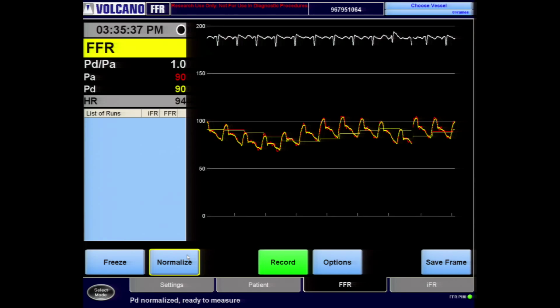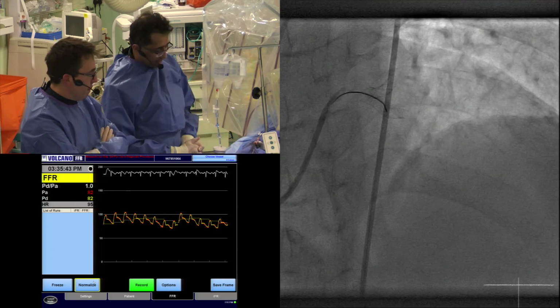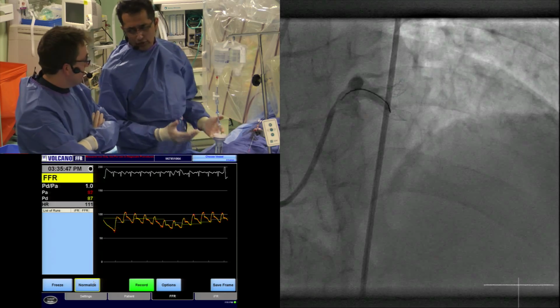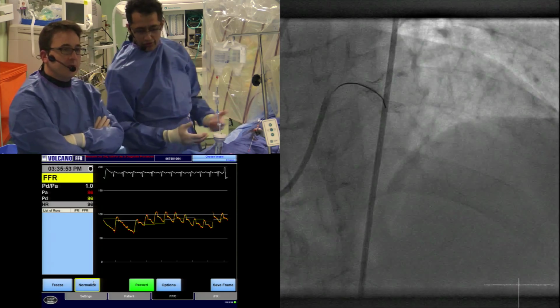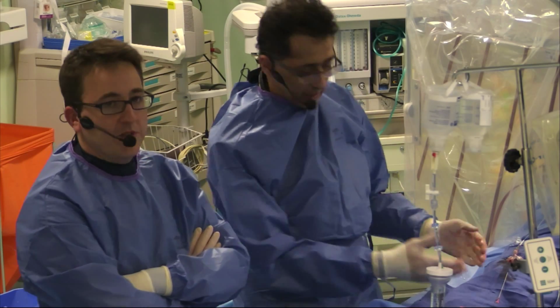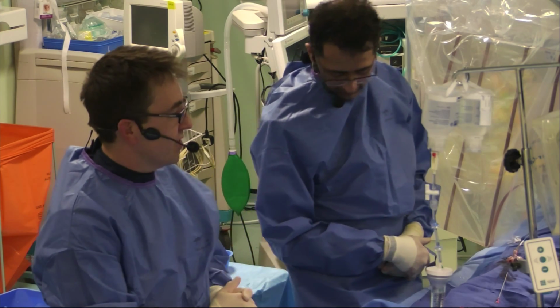Okay. That looks great. Okay, and so just to make the point again, remember the needle introducers come back again. We're sticking with our same protocol. I know that our Korean colleagues have done some work which says that if you keep the needle introducer in the whole time, and you're not giving intracoronary adenosine, for example, then the readings are just as valid. But I think, because the world is getting used to using more physiology, let's do it the standard way and keep the needle introducer out. If you standardise things, make the same measurements at the beginning and at the end and the middle, then you always make sure you have consistent results there.